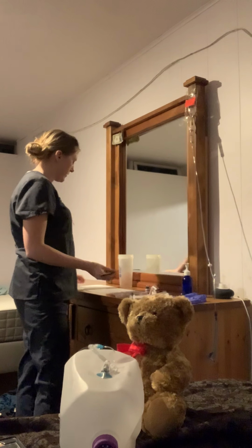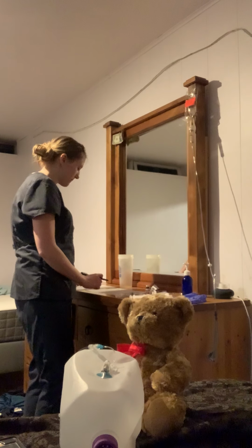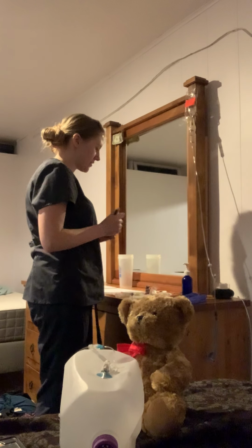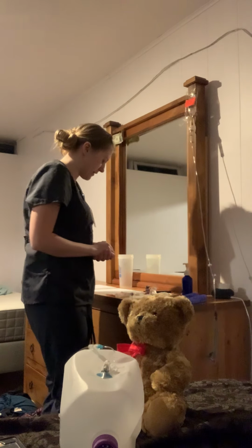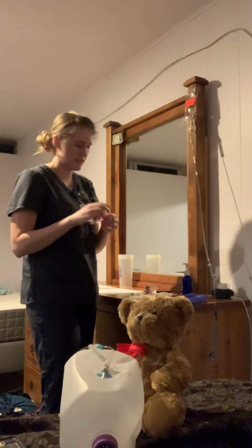And then also, we do have a doctor's order for the furosemide. So I'm just comparing that with the MAR. So that is our second medication check. So now I'm going to put my actual sticker on the syringe here.